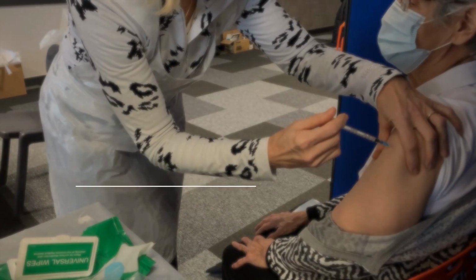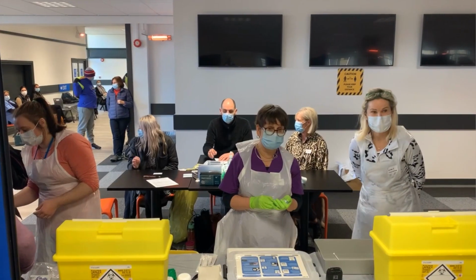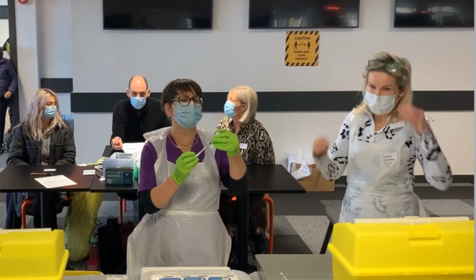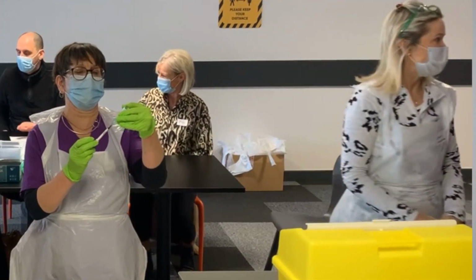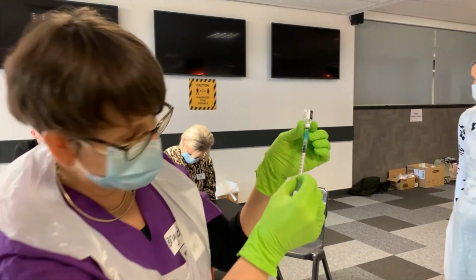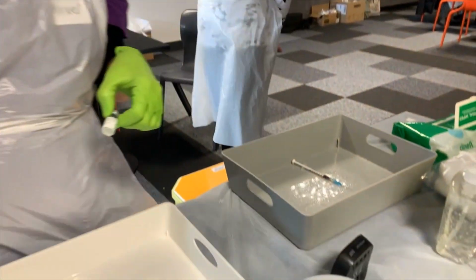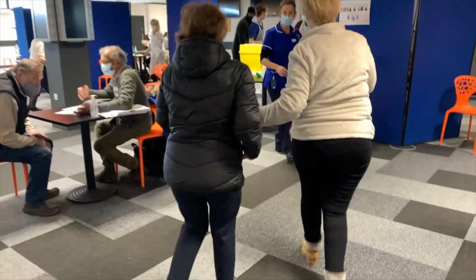Now let's look at the role of the vaccinator. You will be stationed at each end of the table with the diluter in between you. The diluter places a filled syringe into a kidney dish for you to pick up. Remember to take care as they are unsheathed needles.